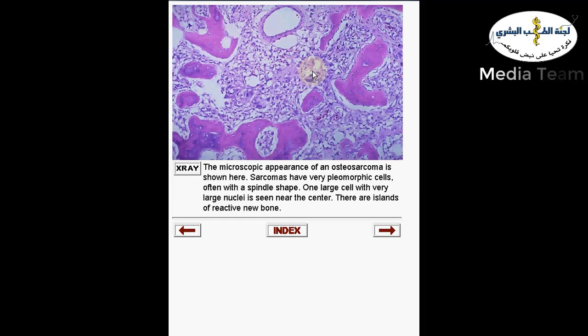If you look around, we will also look for mitosis, especially atypical mitotic figures, and in addition, necrosis. The presence of tumor cell necrosis tells us that this is a malignant tumor. In addition, the fact that this cellular proliferation is infiltrating and destroying adjacent normal benign structures is the most helpful feature that this is a malignant tumor.